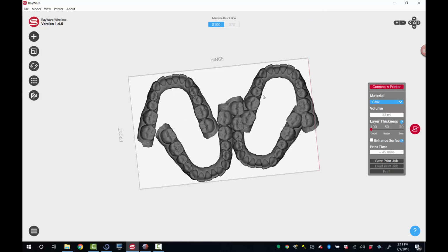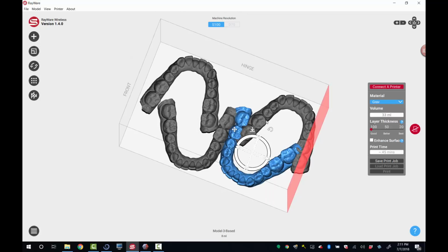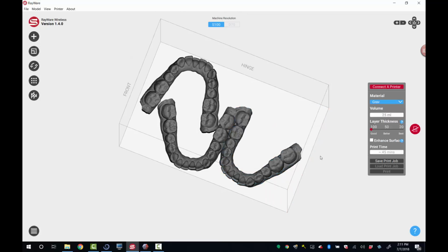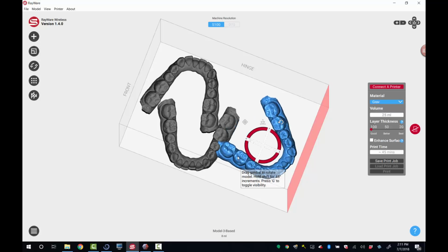So if it's 3 models, 4 models, whatever, the point is I can print them pretty quickly. Okay? So that's the advantage of horizontal. Very fast, with one button click, ready to go. And even if you can only fit 3 models, still you've got those 3 models in very short order. Okay?